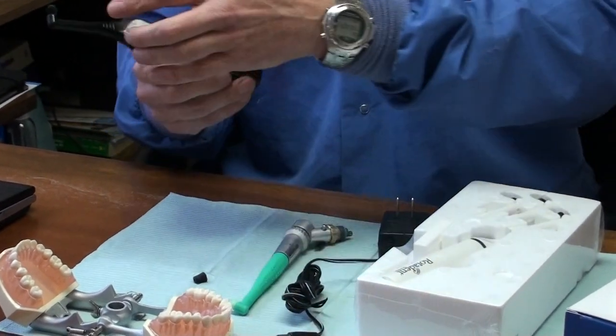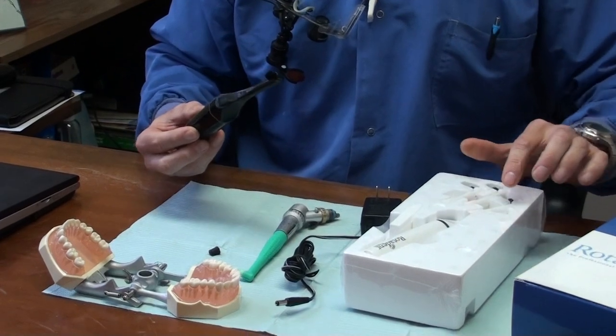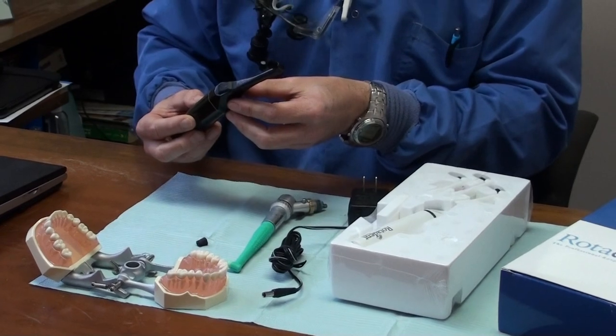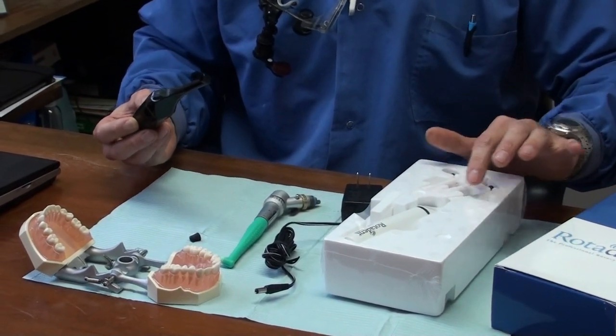It has two brushes. Some of the brushes come with the head, some come out individually — it just depends on the model. This is a newer model where the brush is attached to the head.